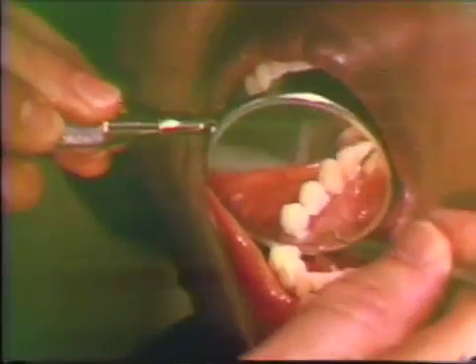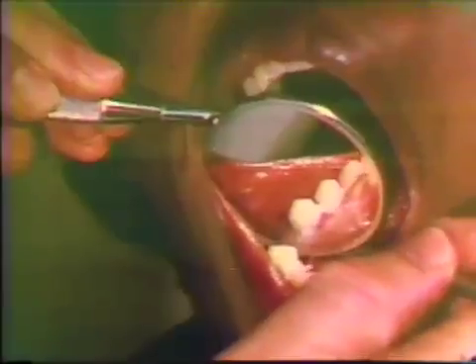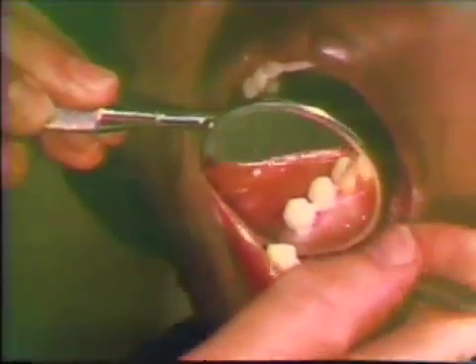After a few moments, the excess temporary cement is removed and the patient is dismissed until the next appointment. The silver-plated working cast is articulated using the wax bite registration, and the replacement crowns are fabricated. The occlusal anatomy is formed against the opposing maxillary cast, and the work model is transferred to the dental surveyor for the alignment of the critical areas of the wax pattern.